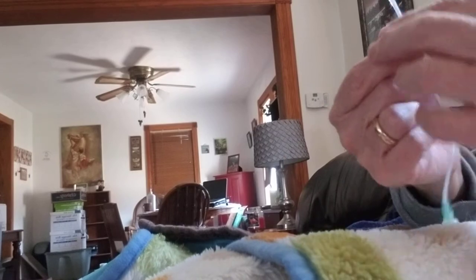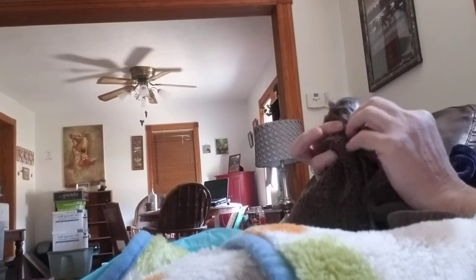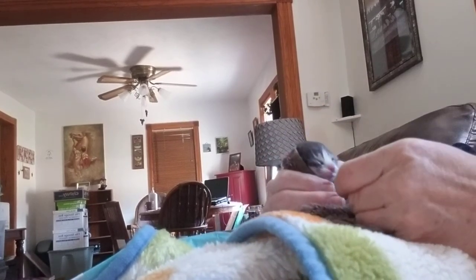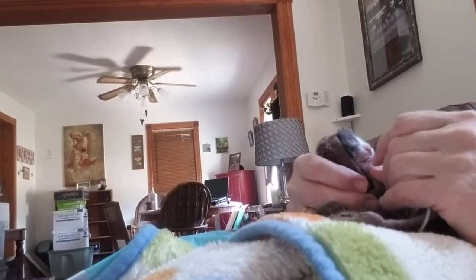And then you take your kitten. Let me set that down just for a minute. And you need to have your kitten bundled so that it can't pull out the tube with its paws. So you just kind of bundle it up. And then you take your lubricated butterfly IV tubing, and you start putting it in their mouth and help them swallow it.